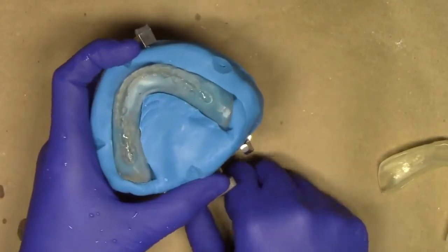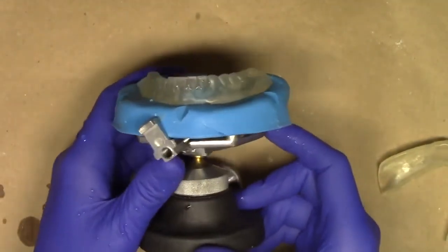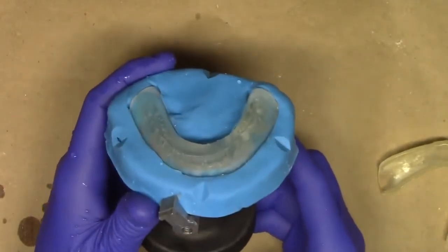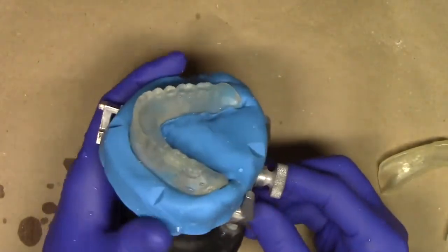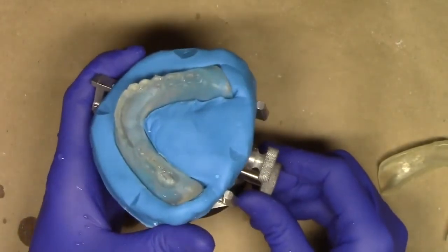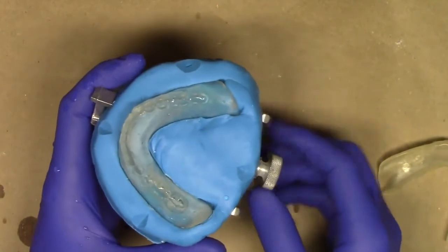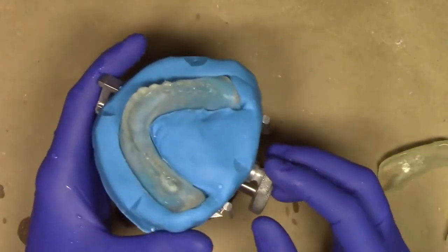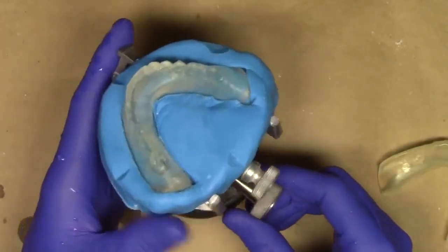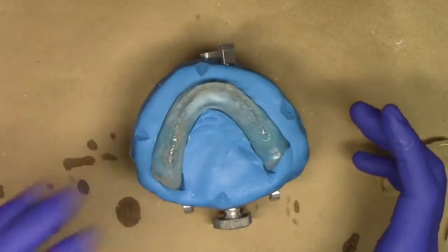Now what's nice about this is we can take this to a drill press. I don't have a drill press that I can very easily record. It's back at home in my garage. But in a current office, you can do this pretty well just using freehand methods, or if you do have a drill press in your practice for making surgical guides, that's fantastic. However, most people don't really have one. You can buy one down at Home Depot or at Lowe's for about $100 to $150 maximum, and I do recommend doing that because you get nice parallels in between the implants.